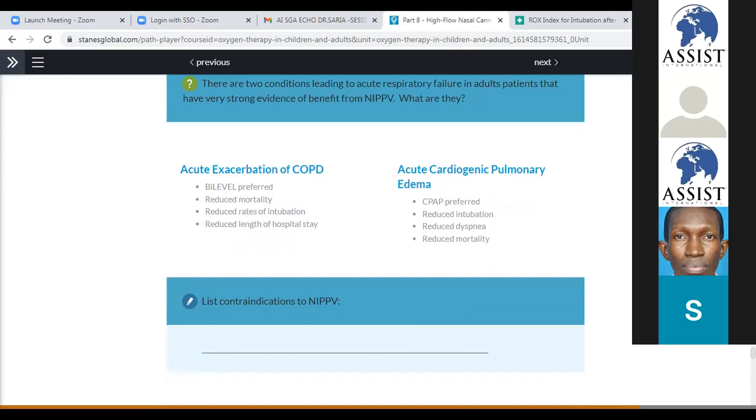And the BiPAP is similar to non-invasive ventilation, it also has two different levels of pressures, and you can achieve it in different ways. But sometimes in BiPAP, the only thing which we'll add in there is that you will even have the possibility to set the respiratory rate. Plus, even if they fail to breathe, there will be some sort of backup respiratory rate set.